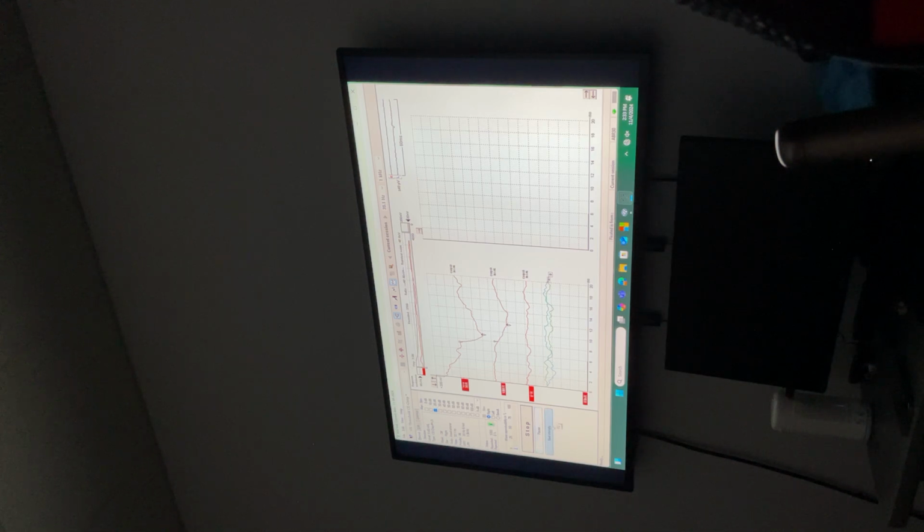Let me measure at 20 as well. I did not take this as wave 5 because that matches with that of 30 dB. So what about 20? At 20, definitely there's a response, right? You agree with 20? Yeah, that's definitely it. So this is 20.